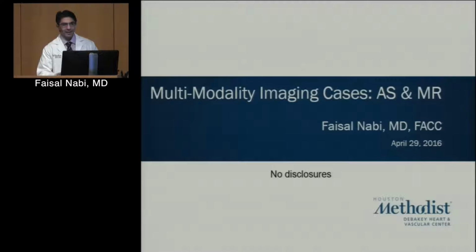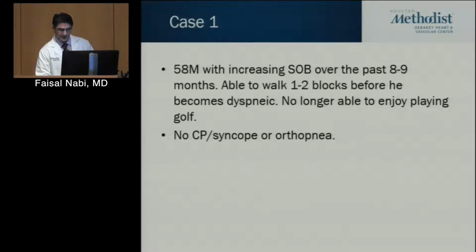So hopefully I have an interesting AS case and then an MR case if we have time after that, but I'll just show you some of the things we're doing here at Methodist.